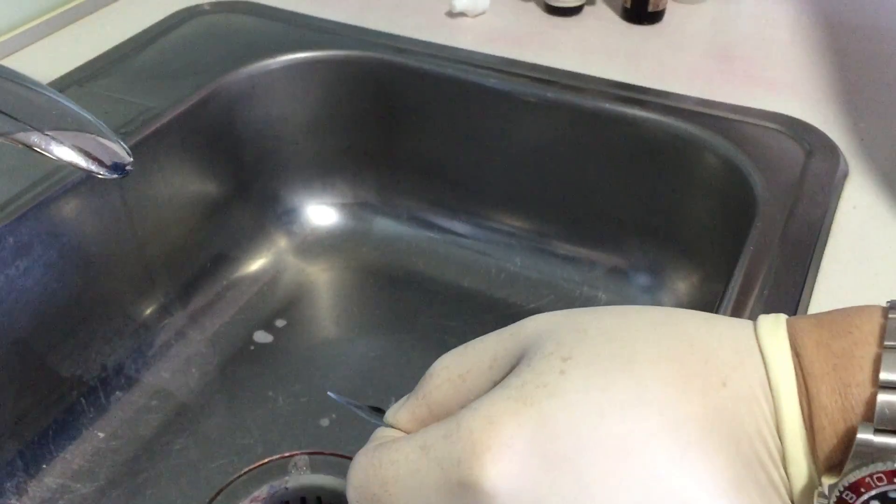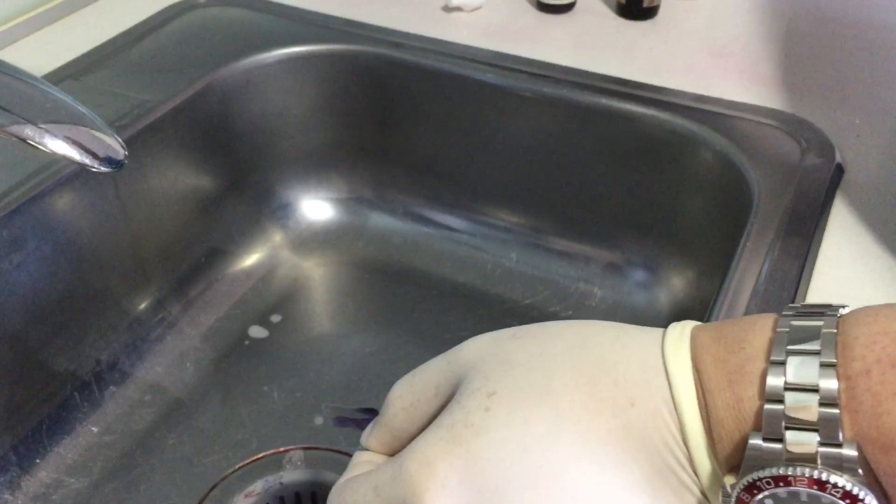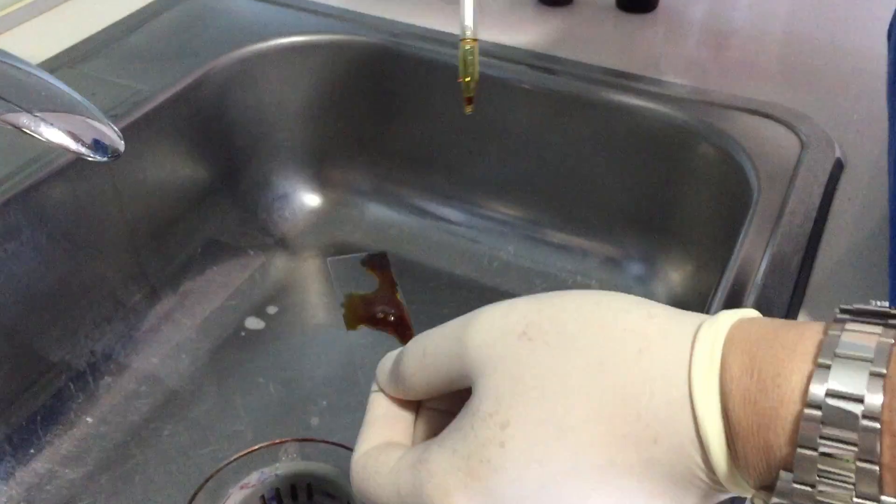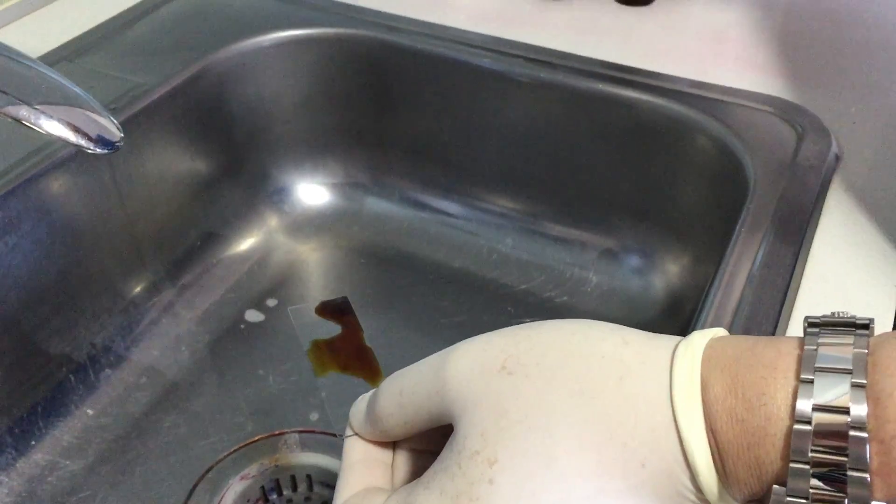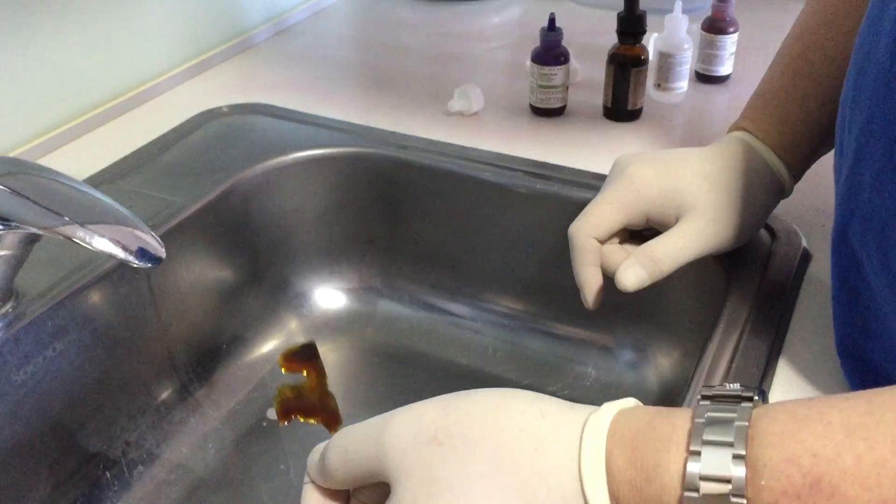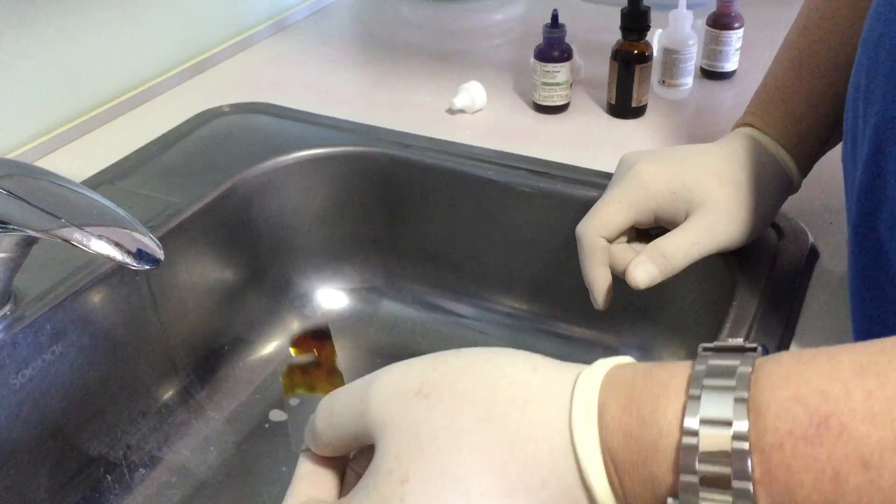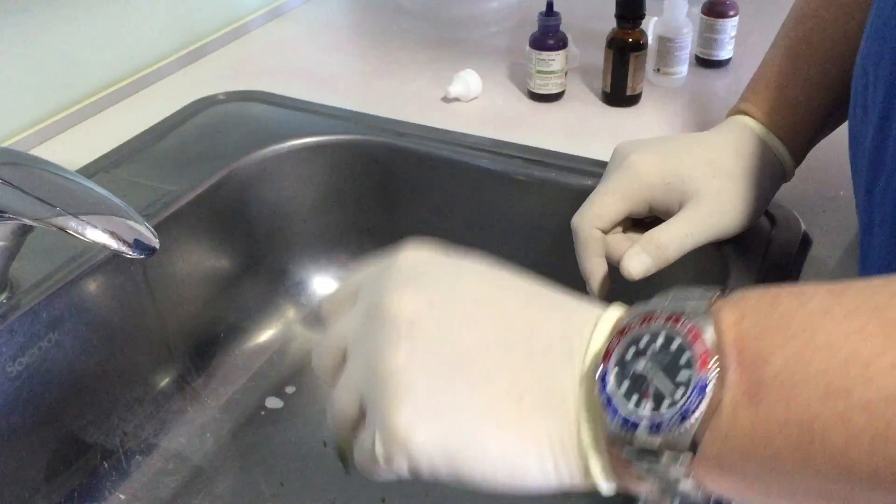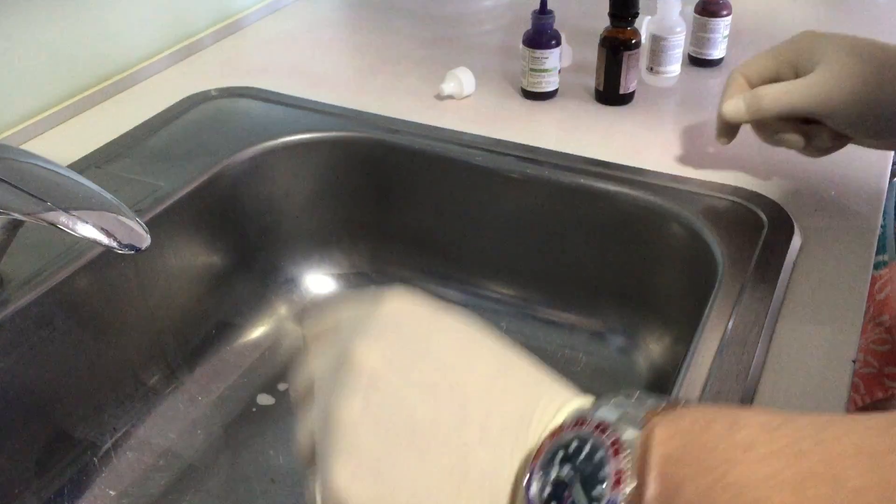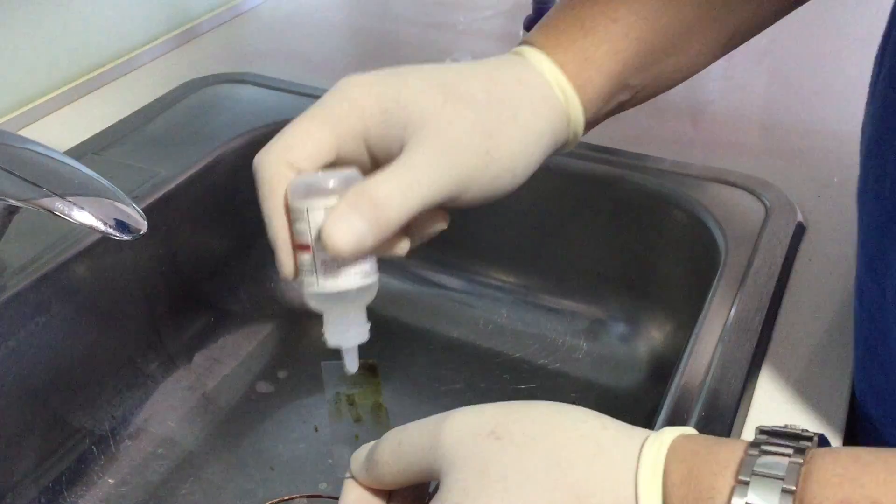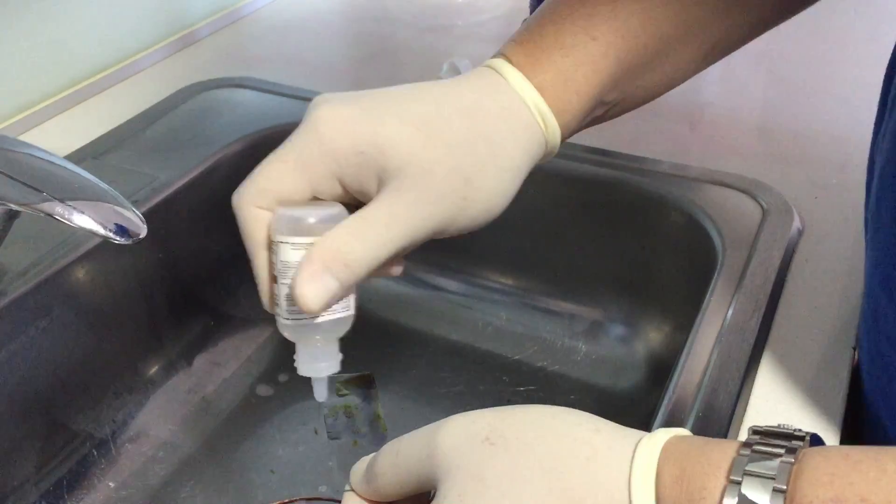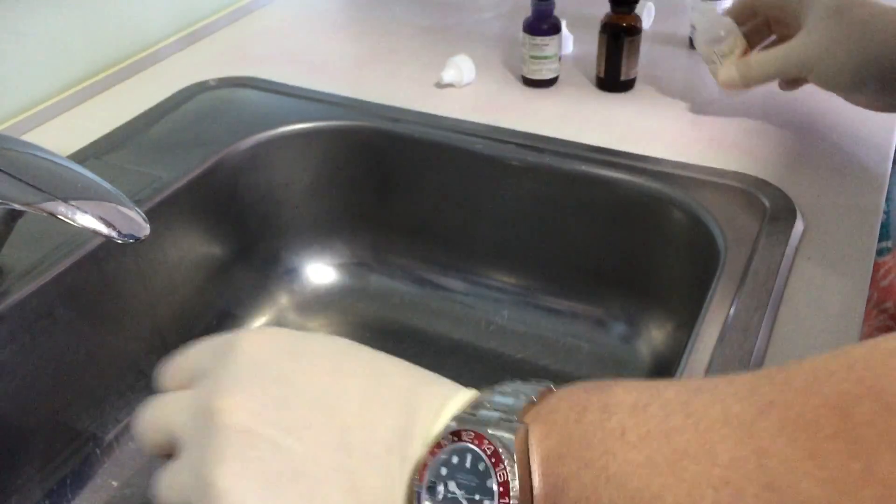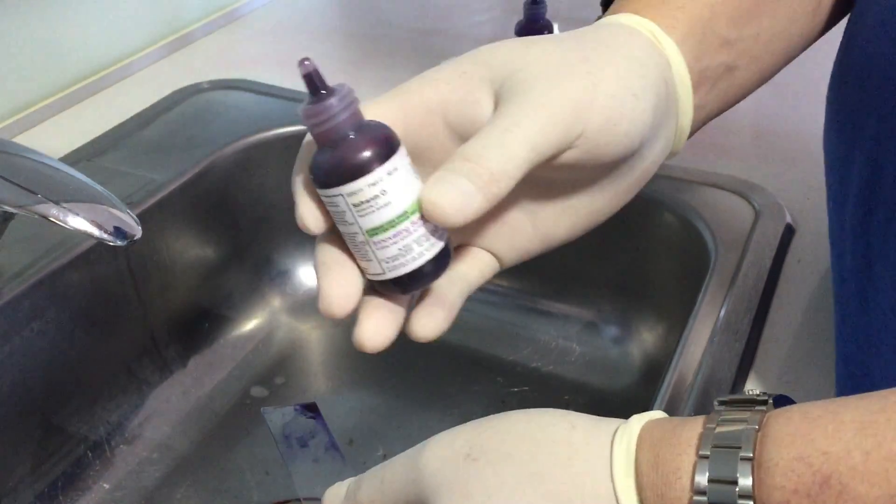Okay, now we're going to use gram's iodine. The last two days the cells have been quantified already, so I just wanted to show you guys how cells change day to day. Now we're going to use alcohol, and last, safranin.